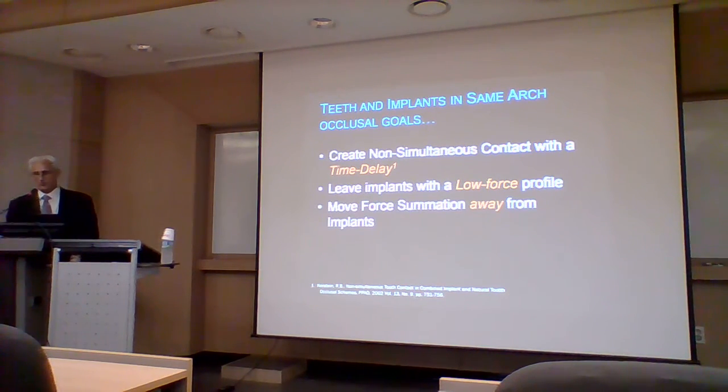And we try to keep the total force summation away from the implants if possible.